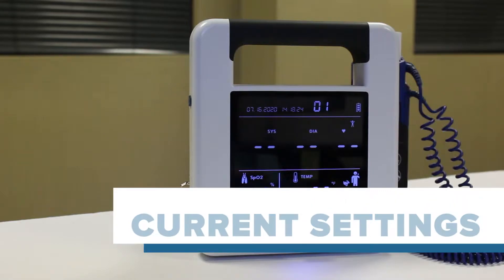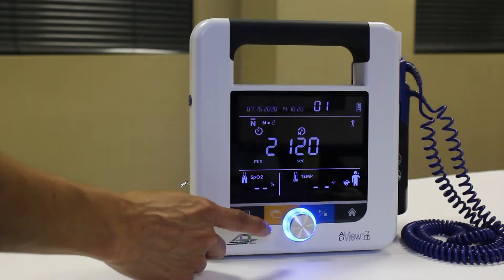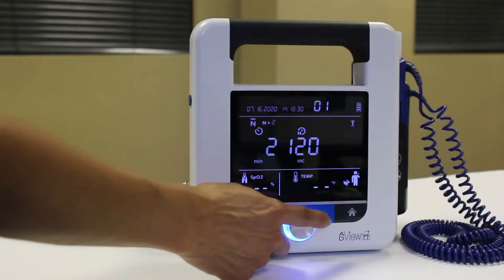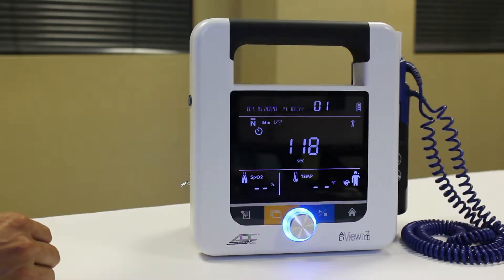Changes made to the average measurement settings will remain in effect until they are changed again. To take a blood pressure reading using your current settings, simply press the mode toggle button until you see the average mode icon, then press the start-stop button. The sequence will begin.